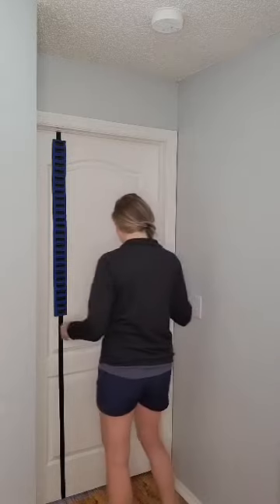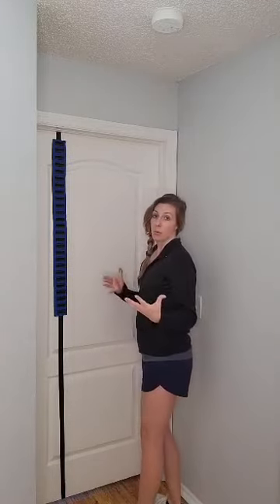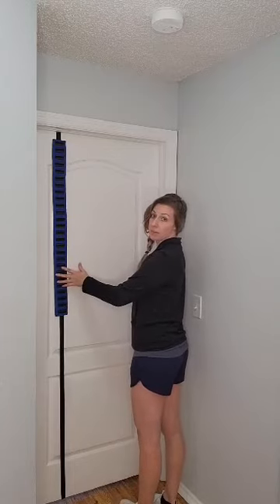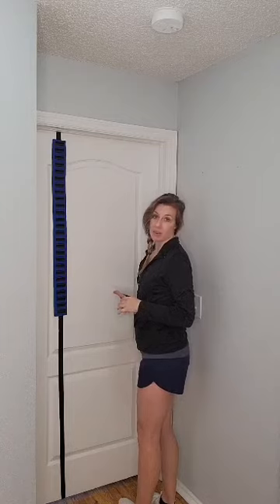worse. So when you practice this, you'll already have your finger ladder attached to your door. Position yourself so that you're actually a couple steps to the side. Now, depending on what arm you're working on will depend on what side that you step to away from the ladder. So I'll be demonstrating how to do this with my right arm, which means I'm going to step a couple steps to the left of the finger ladder. If you're working with your left arm, you'll move towards the right side of the finger ladder.